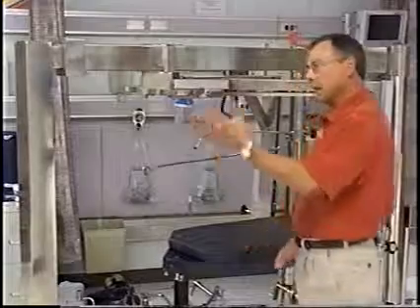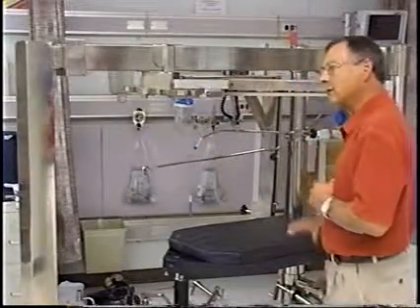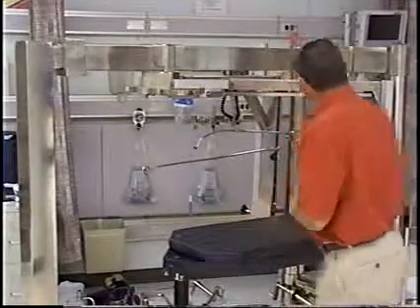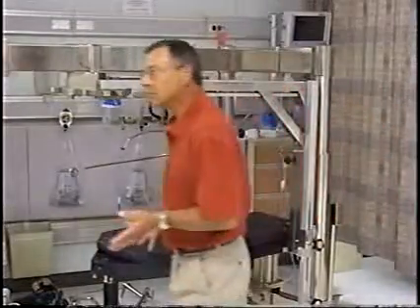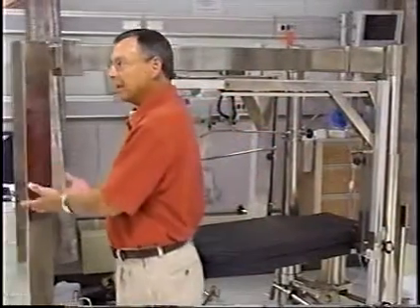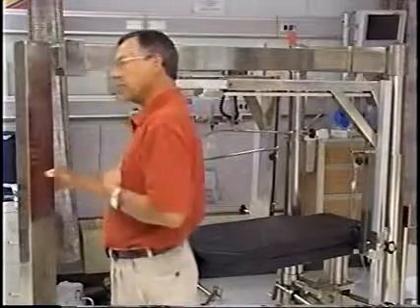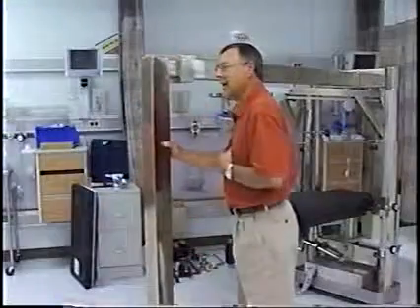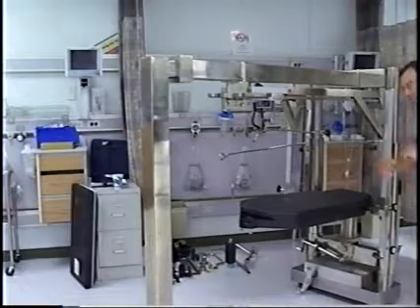So let's assume, Amy, that you're on call and you're in to set this up for a left hip. The hardest thing you're going to do to set this table up is to get it into the room, because you can see it's big, bulky, heavy. It weighs 725 pounds, and don't try to move it by yourself. You can move it, but you can't guide it. All right? So let's assume you get it into the room.